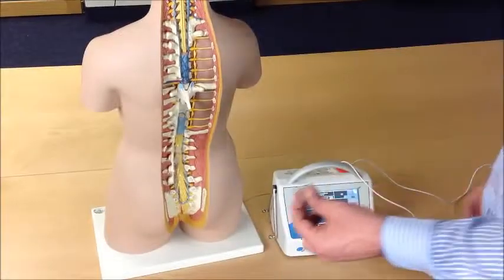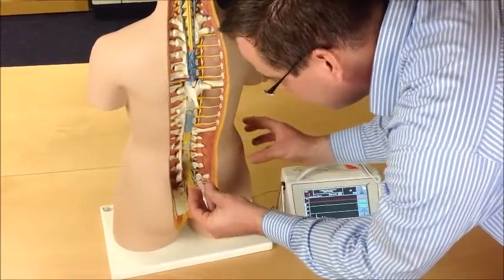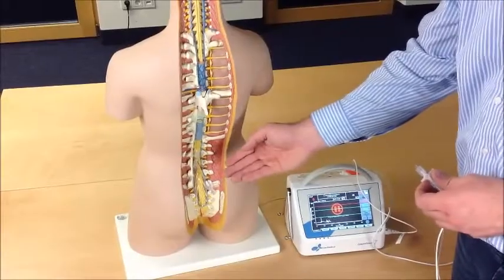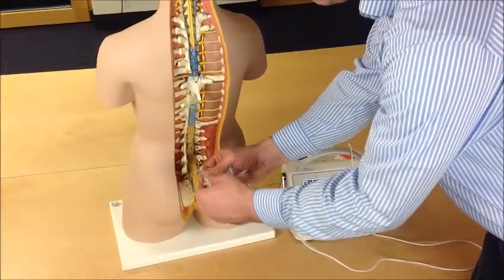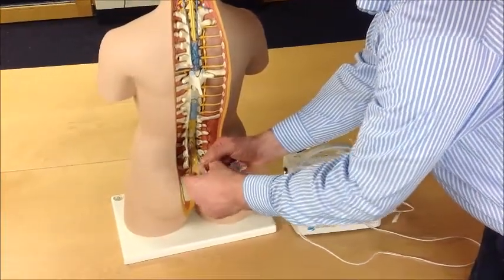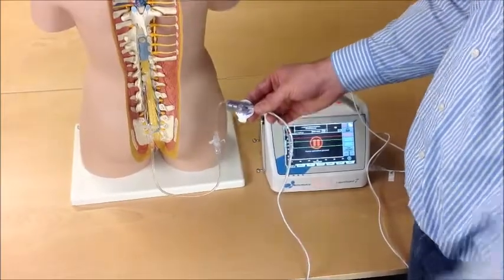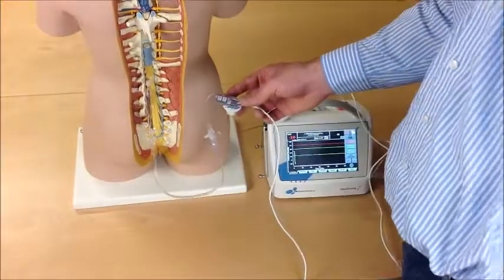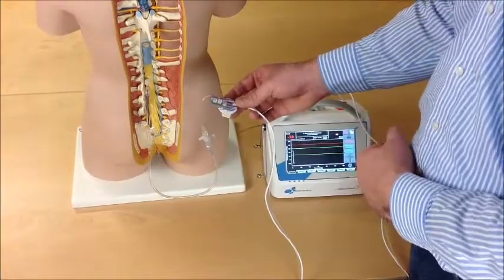Prick the patient with a needle. Wait until CSF runs out of the needle, then connect the LiquorTube set to the needle. It may happen that the tube is too short — in this situation, use an extension of maximum 30 cm. Make sure there is no air inside the extension.